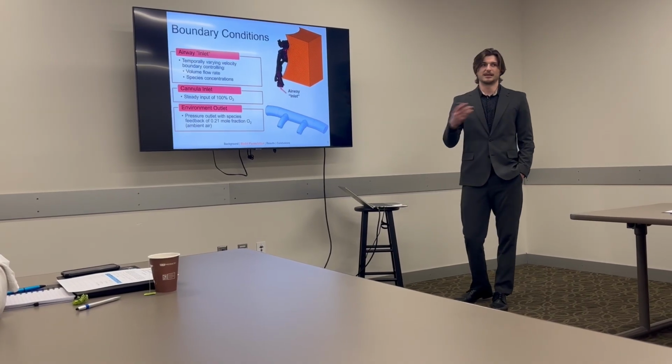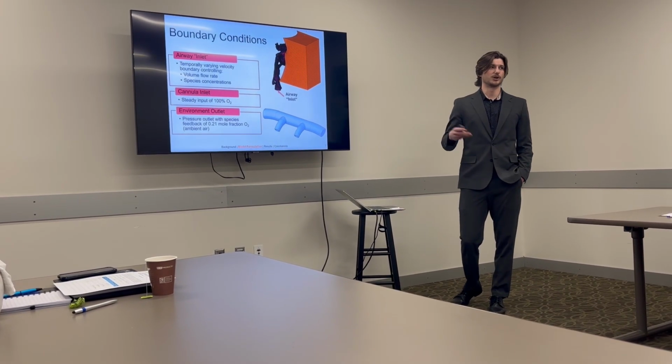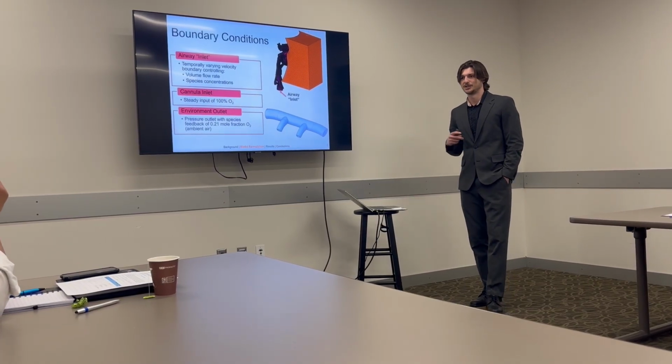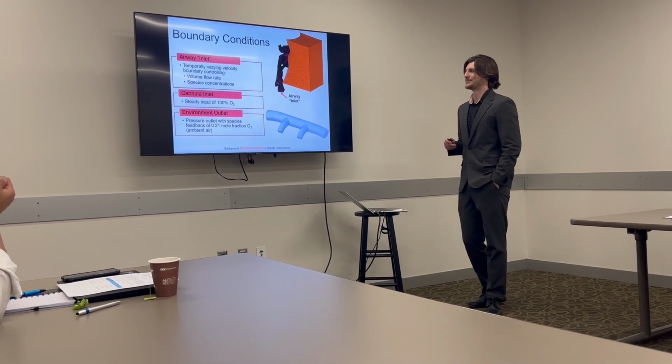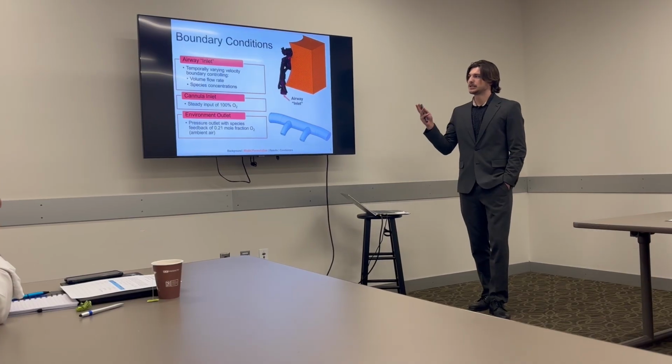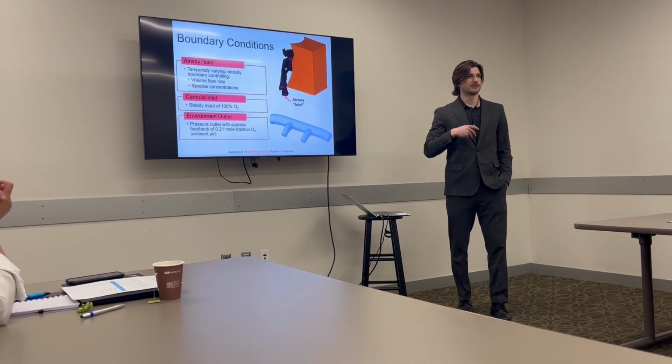We also use that same apparatus and a 3D printed airway for our validation study, but we're not really going to go over that much in the presentation today, but if you have questions, I'd be happy to answer those at the end. And then we also track species concentrations during the inspiratory phase.